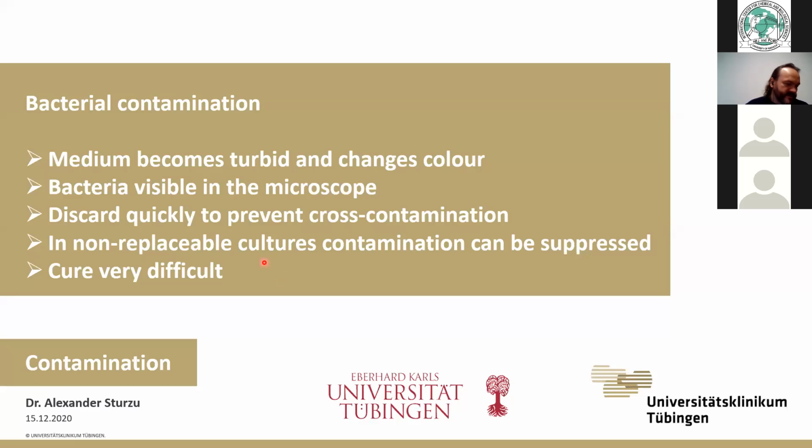However, you have to be mindful that you cannot be conclusive that your experiment has not been influenced by the presence of bacteria. But you can suppress the contamination with high concentrations of antibiotics. But these antibiotics, in the long run, can only suppress the contamination and cannot cure it, because they don't actually kill the bacteria, they just prevent them from multiplying.